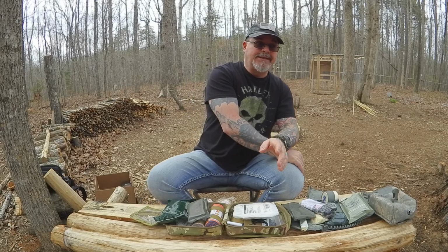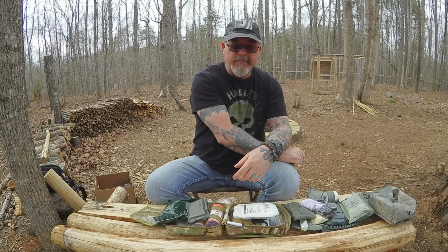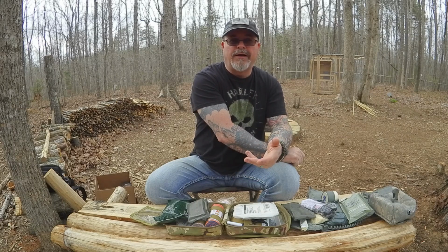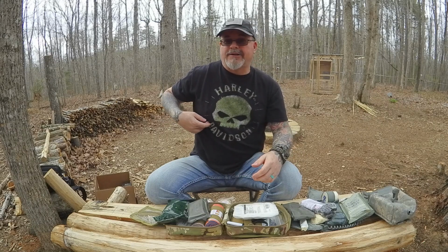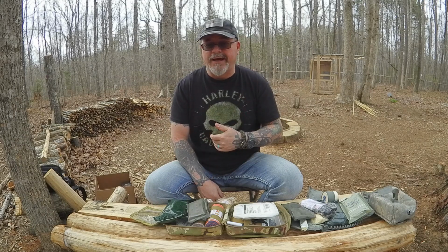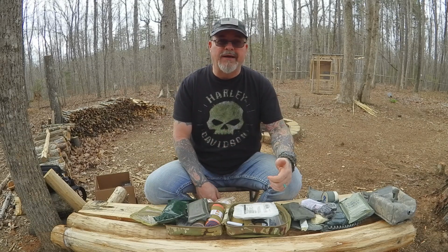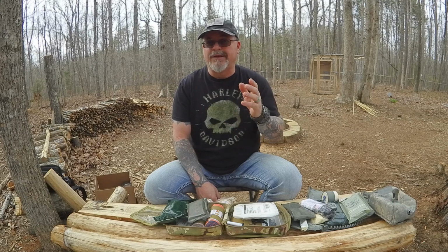Now, like I said, some of these kits out there have things like the needle for a collapsed lung, being able to go through the ribs right here and actually uncollapse that lung and get air back in it. Well, if you're not trained on how to put that needle through the rib into the lung, you can end up killing somebody doing that. Learning how to use a trach, where you're running a trach down somebody's throat, there's a technique to that, and if you're not trained on how to do it, don't practice, you could end up killing somebody.